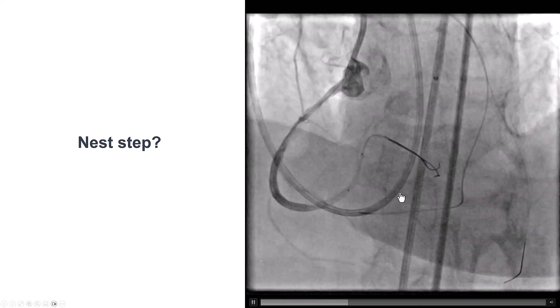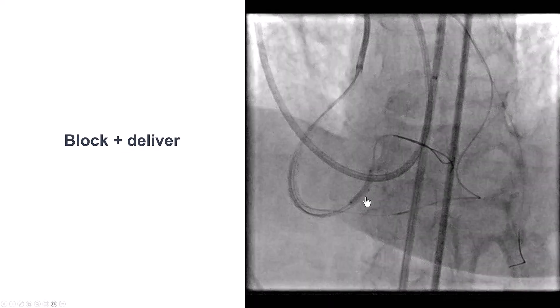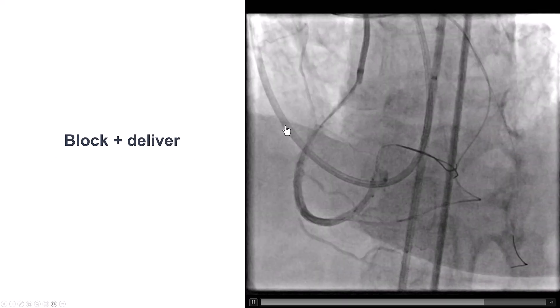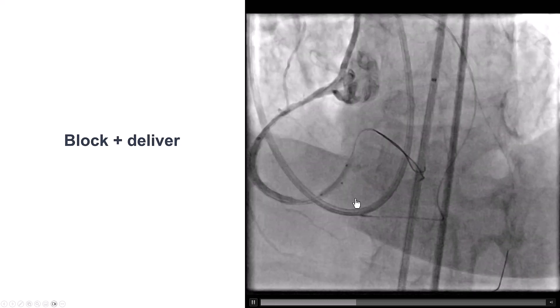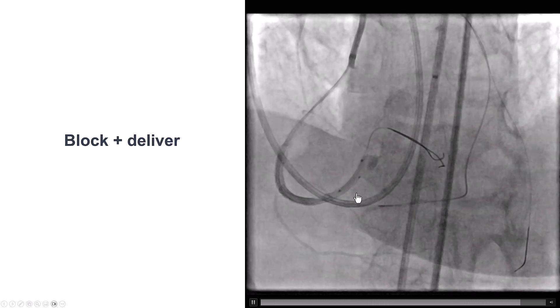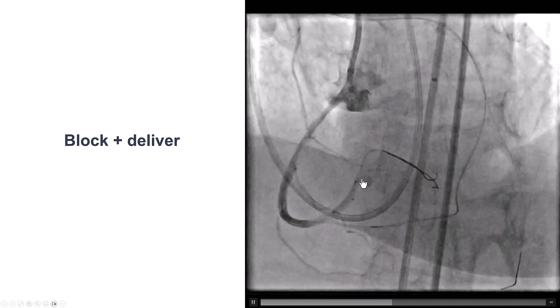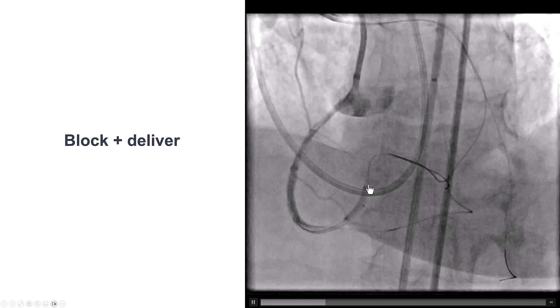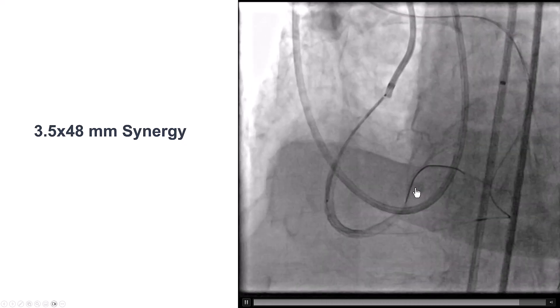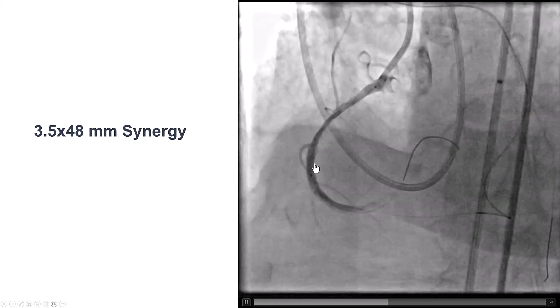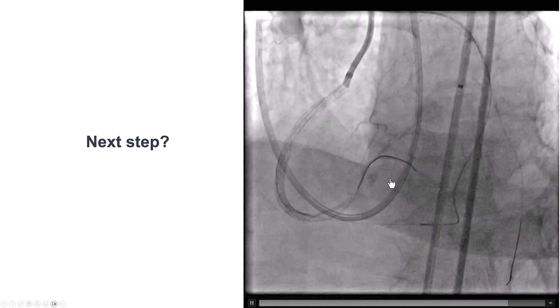After deliberation, since this did not seem to be getting better, we decided to potentially close it using a coil using the block-and-deliver technique — a balloon stopping bleeding into this branch, with a Finecross advanced to the origin of the vessel. However, it was difficult getting into this particular perforated vessel, and our concern was that delivering coils or fat would potentially lead to loss of this last posterolateral. Moreover, after prolonged inflations the stain appeared more stable, so we decided to stent the proximal vessel with another long drug-eluting stent. There was still slight staining, but no pericardial effusion on echo.